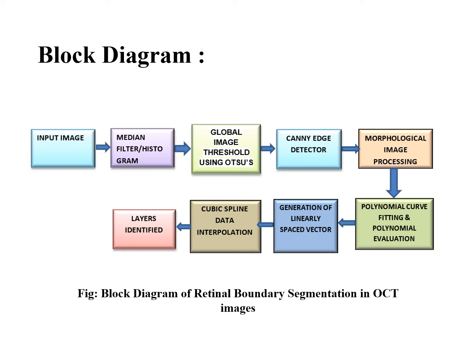Further, the resulting image is fed to histogram equalization, where the enhancement of the image is carried out based on the uniform distribution of pixels towards the gray shades of the image. During this process, a histogram plot comes into action which indicates the relationship between the number of pixels and the corresponding intensity value. Thus, enhanced contrast of the input image is obtained.